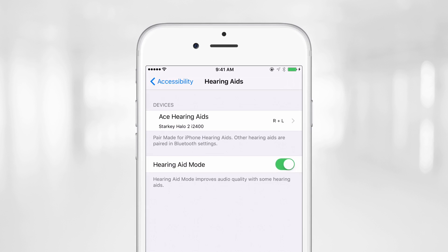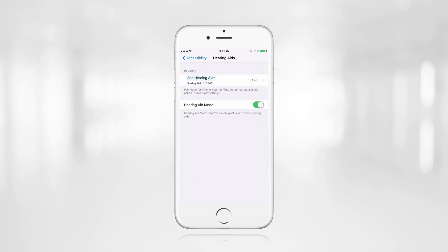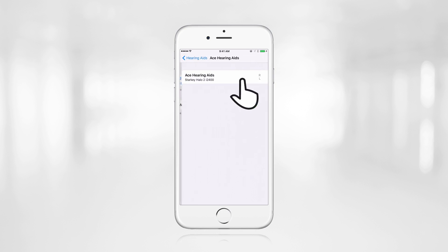The hearing aids will be identified using the patient's first name followed by the words Hearing Aids. Tap on the hearing aid name and a pair prompt will pop up. Simply click on Pair to wirelessly connect the hearing aids to the iPhone. This pair prompt will appear twice, once for each hearing aid.